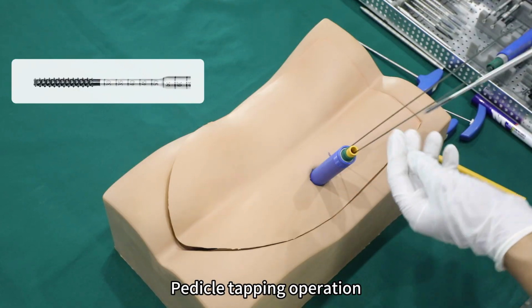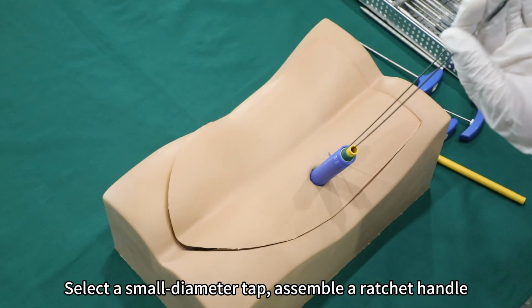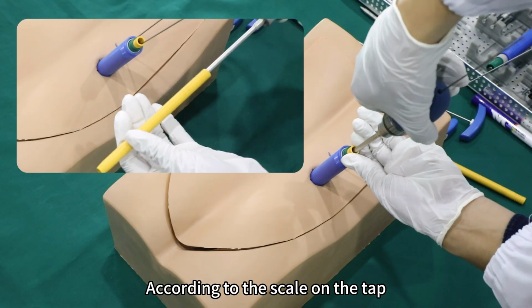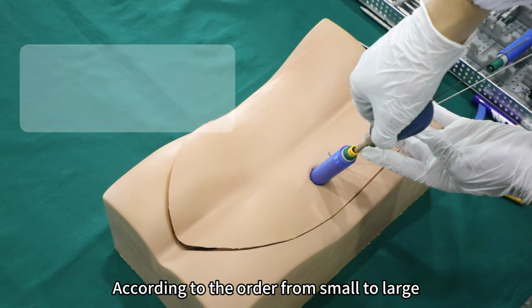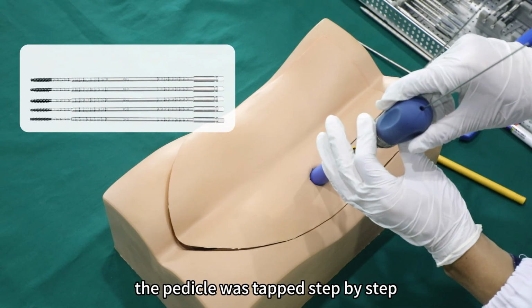Pedicle tapping operation. Select a small diameter tap, assemble a ratchet handle, and start tapping the pedicle along the guide needle. According to the scale on the tap and combined with the secondary sleeve, the tapping depth of the tap can be controlled. According to the order from small to large, the pedicle was tapped step by step.